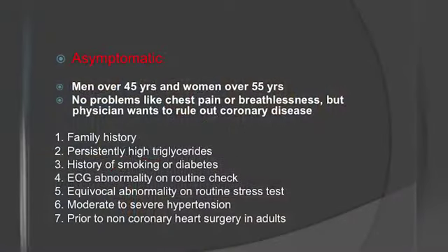So this entire group of patients with atypical chest pains and the symptomatic group are recommended to have coronary CT angio, but with limitations, and I'll come to that. I put this in red here, the asymptomatic group, because this is the group which is in flux. There are people who support this, people who don't support it, and the guidelines actually do change over time.